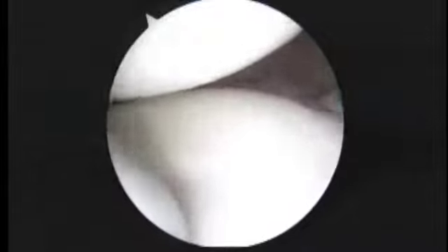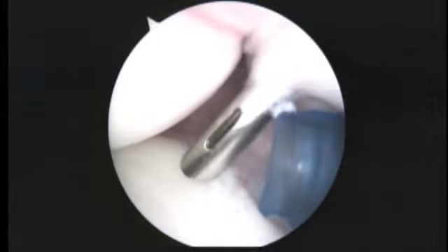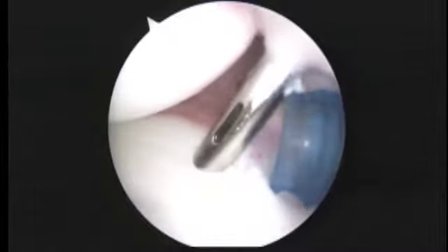Okay, so we'll take a spinal needle. Looks like we could place our anchor down around here. That'll give us a chance to repair everything. Okay, so hold the camera there. I need the blunt. I need to insert there. Pause, please. Okay, here's our drill guide coming into position. We're going to place the anchor right about here. It's a good spot.